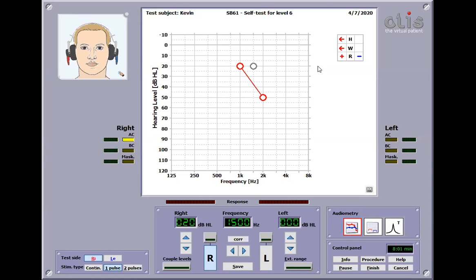That's our first ascending. That is our second ascending. I'm not very sure about 2K. Yeah. Okay. Yeah, that's about 50, 55, not too concerned. So let's move on to 4K.